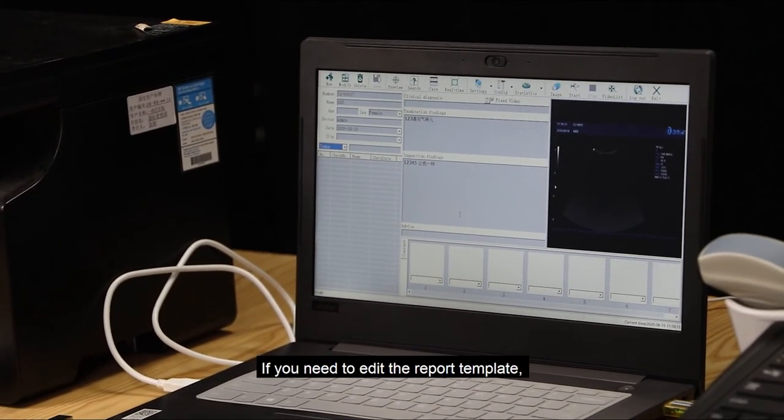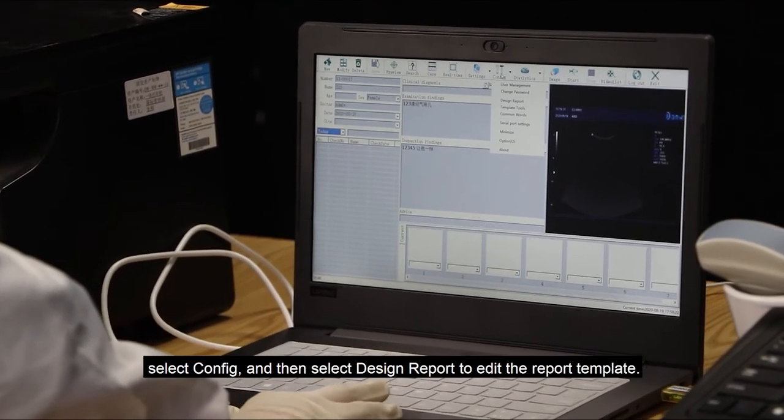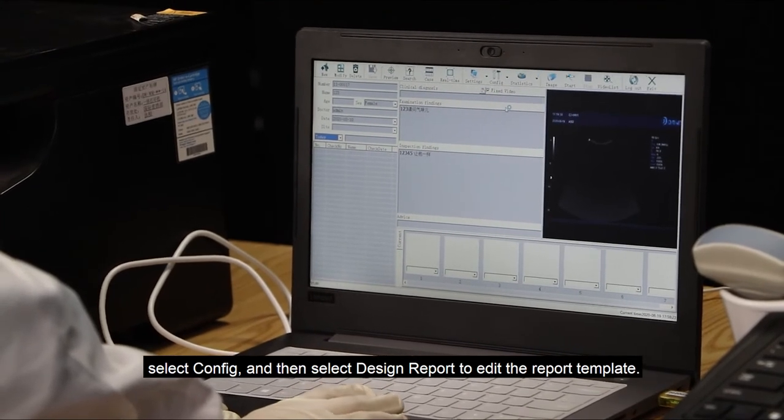If you need to edit the report template, select Config and then select Design Report to edit the report template.